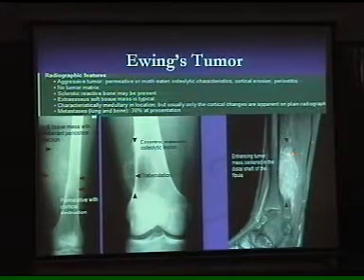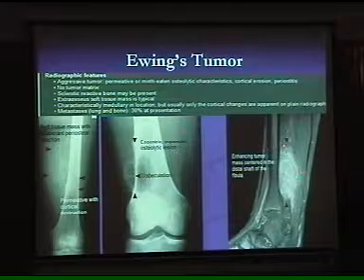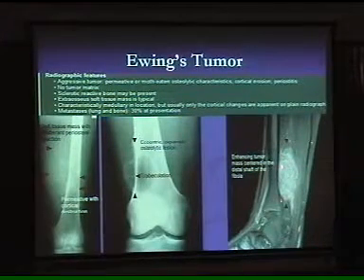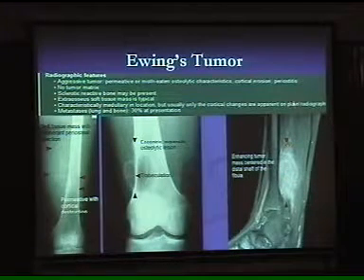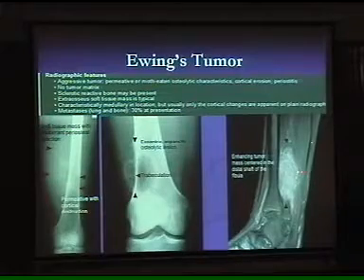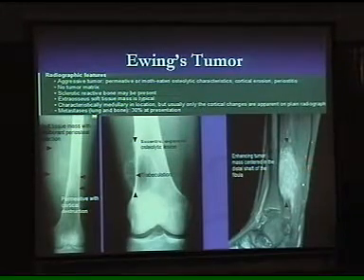If you look at the MRI and look at this bone over there, there is heterogeneous hyperintensity on T1 weighted contrast imaging. You can see the growth. The bone is well preserved beyond that and well preserved just above that. So that is the area which is evolving. At the same time, it is involving the distant soft tissue muscles over there.